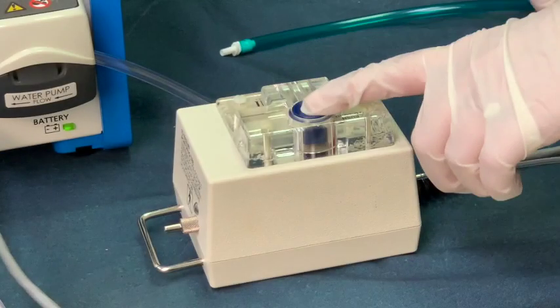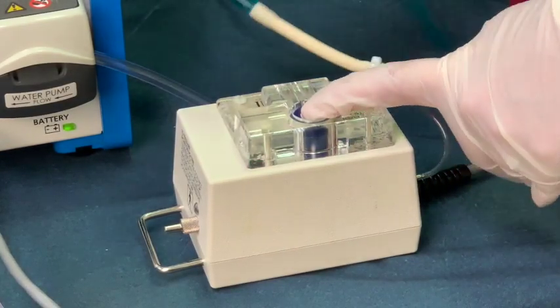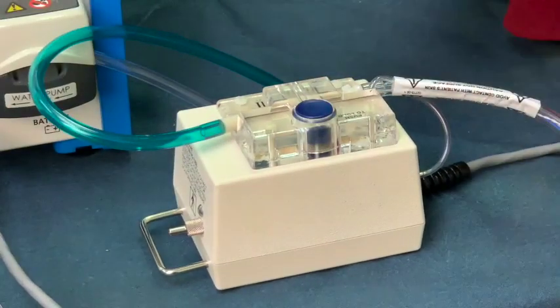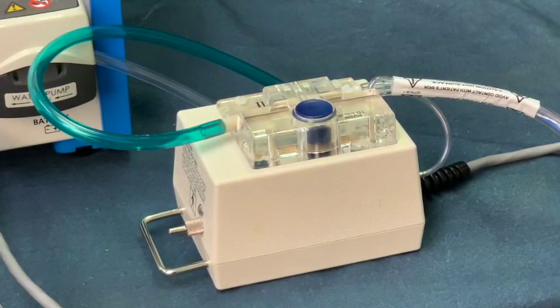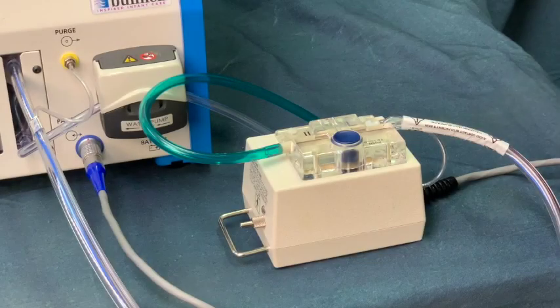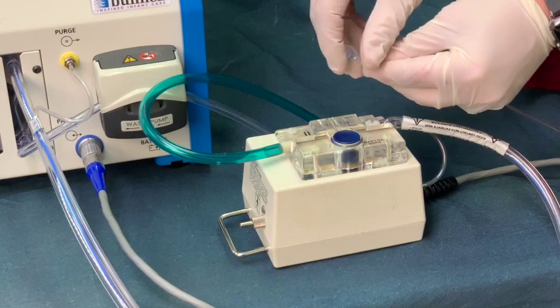Now press the push-to-load button on top of the patient box and, holding the tubing in both hands, gently stretch the pinch tube into the jaws of the pinch valve. Connect the clear pressure monitoring tube from a Life Port adapter to its port on the patient box.